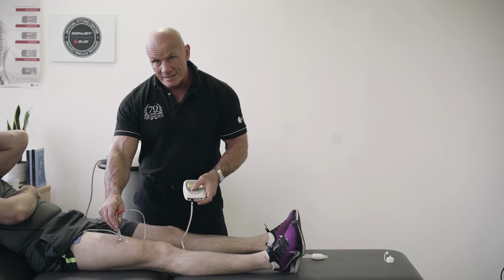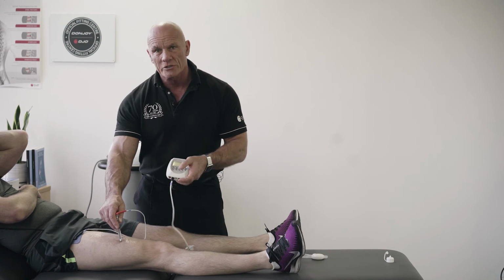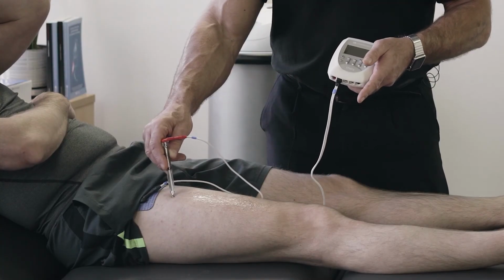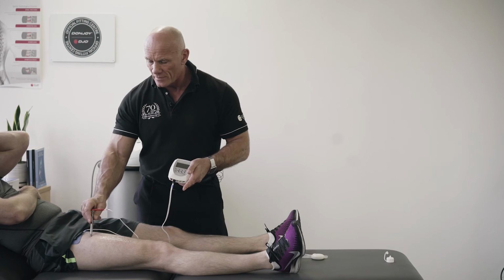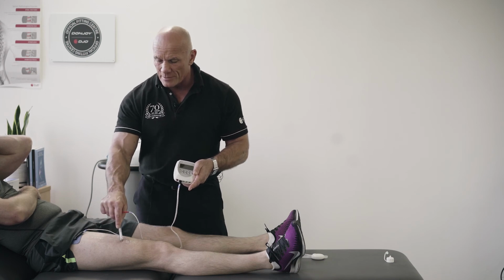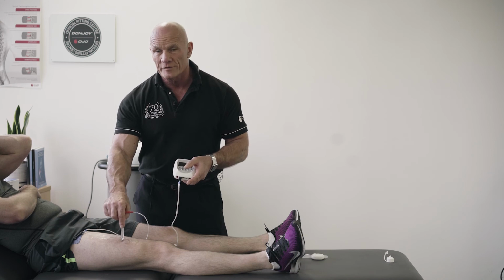If you read the anatomy books, they would tell you that the motor point will normally occur at the junction of the superior third to the distal two-thirds of the muscle. So I would have expected it to be here. So had I put it here, the impulse now has to travel through this very sensitive material called skin to get to the motor point to go into the muscle. Hence, it will not feel comfortable for the patient.